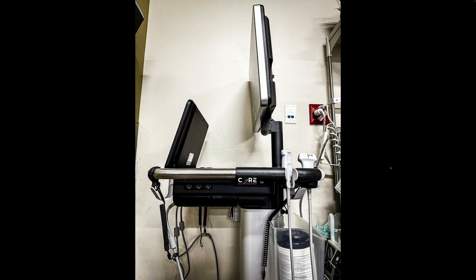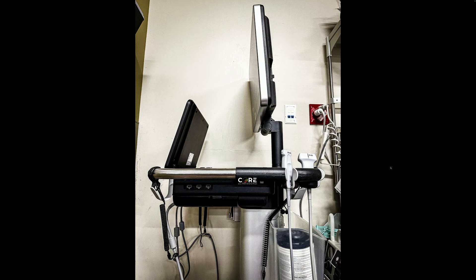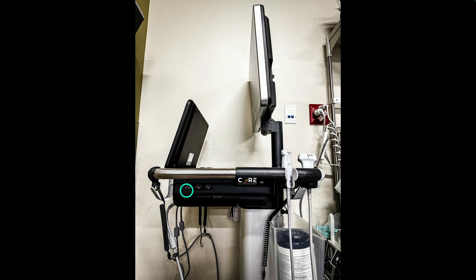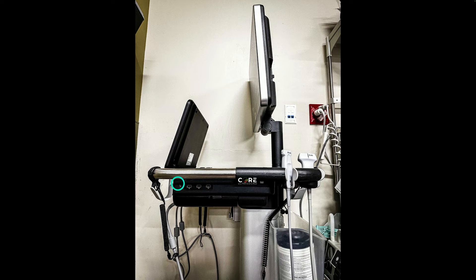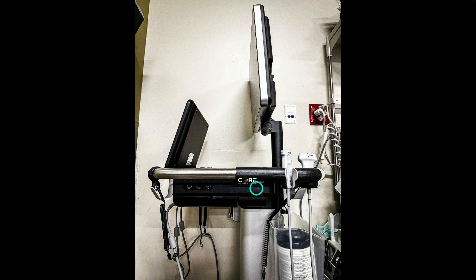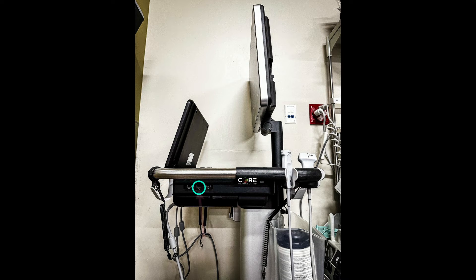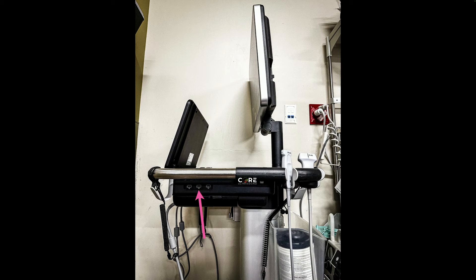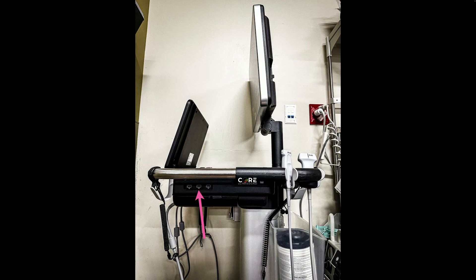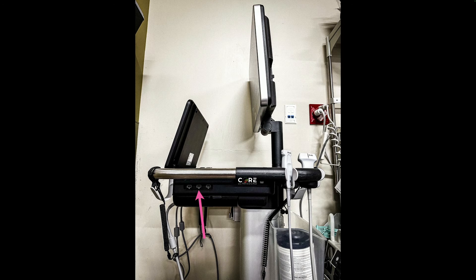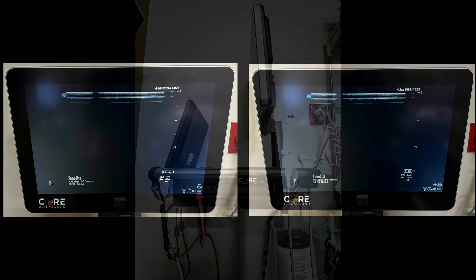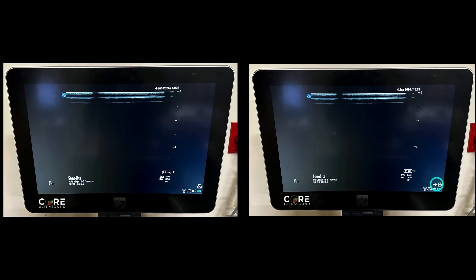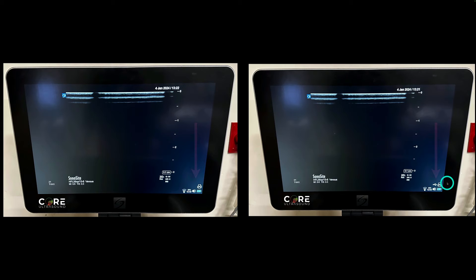Now let's talk about how to export your clips. Hopefully you have your ultrasound machine integrated into your EMR. You don't have to do this, but just in case you don't, this right here on the right side of the main kind of tray of the export, there are three USB plugs, and you can basically plug in your HIPAA compliant thumb drive into that slot there. And you can see that here on this side, I have nothing plugged in. And then right here, I see the USB kind of symbol here. And this means that the machine recognizes it.